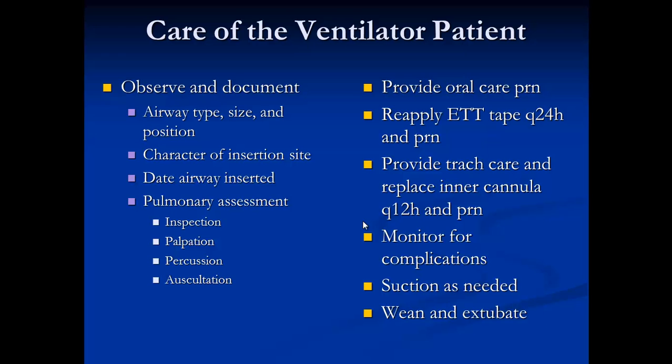For respiratory rate and minute ventilation, choose the respiratory rate and minute ventilation appropriate for that particular clinical requirement. For PEEP, basically you have to achieve plateau pressure and PEEP.